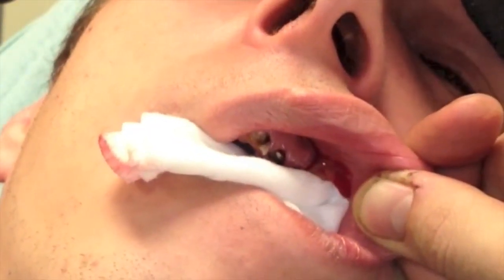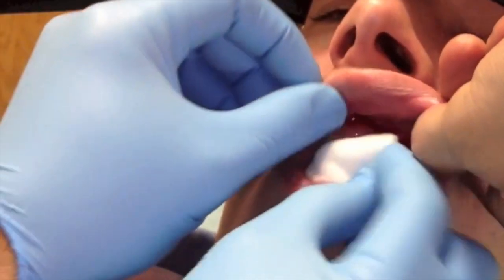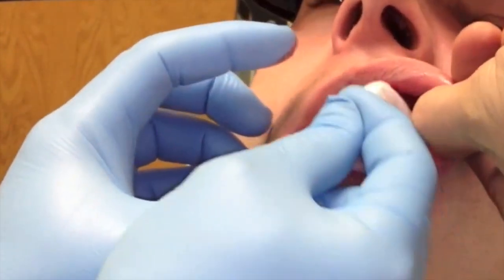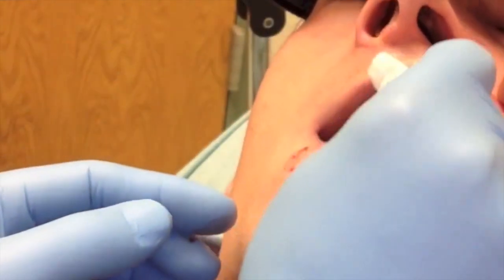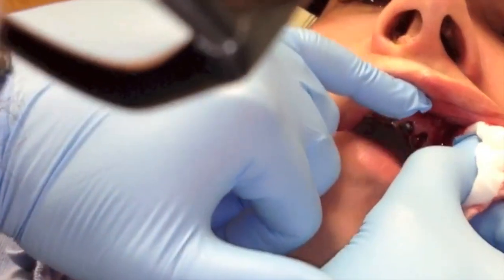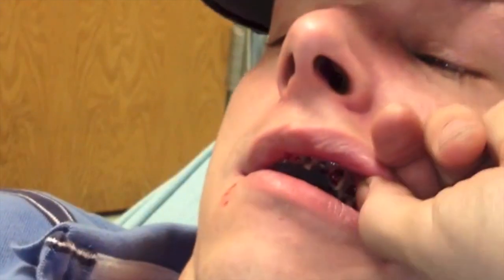As you can see, it kept coming out, so I was leaving the gauze there to absorb, but it wasn't doing a very good job, so the patient had to spit out and clean it up. Here I go with a gauze to clean up the area and make sure I'm milking most of the infection out. As an outpatient, I'm going to tell them to do warm gargles with half water, half peroxide, and of course use oral antibiotics and follow up. Here I'm using the gauze to milk and make sure I got all of the abscess, then tuck the gauze in there to slow the bleeding from the injection.